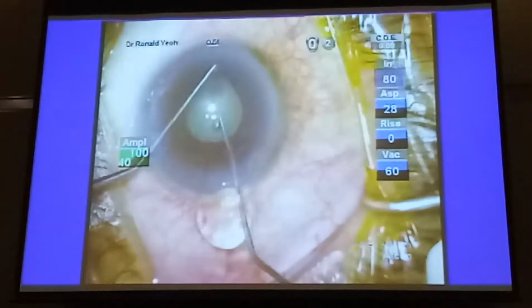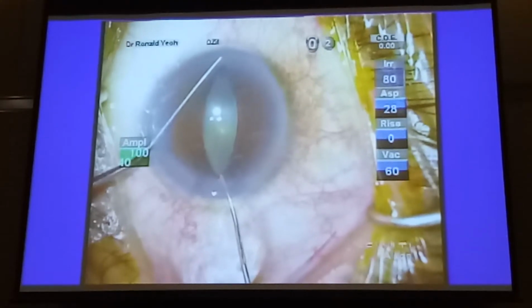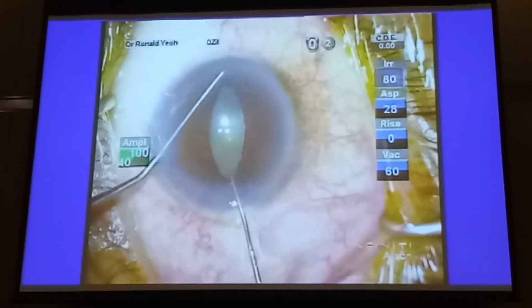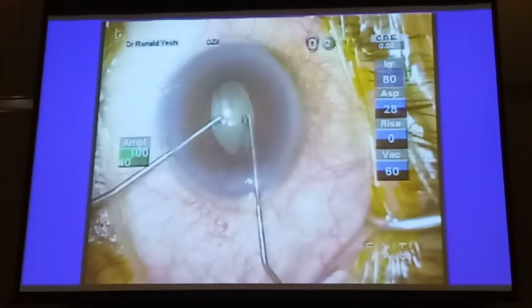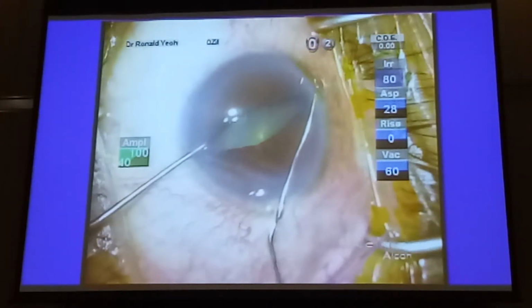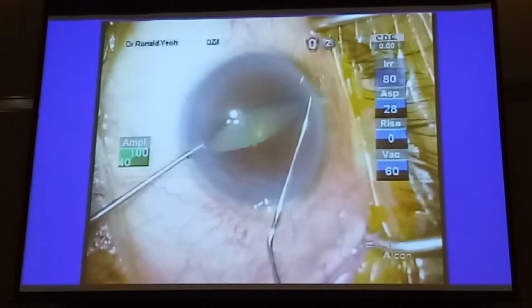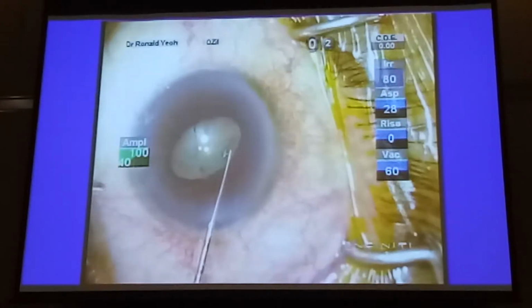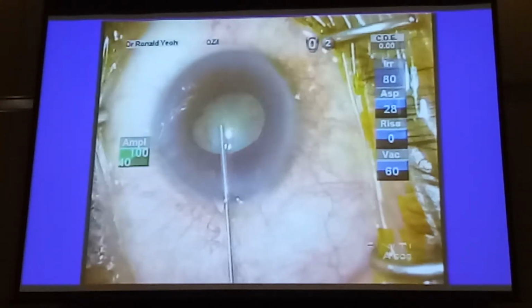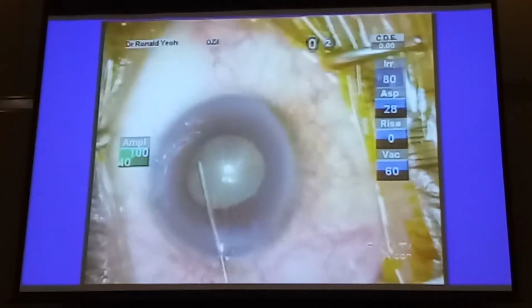And here you see me using 2 Kuglen hooks, just stretching the pupil in one direction first. And this of course breaks a few sphincter muscles, but it saves us having the expense of using a Malyugin ring or iris retractors. And so we stretch it in one direction, then the other direction, and then you can rely on the OVD to just dilate the pupil up a little bit more to allow you to proceed with the capsulorhexis and the surgery. So here with the OVD going in, you can see the pupil's a little bit better. Just now it was perhaps 3, now it's 4 to 5 millimeters.